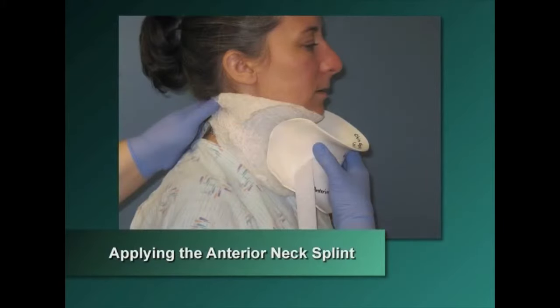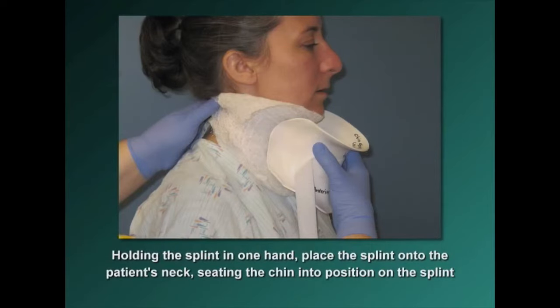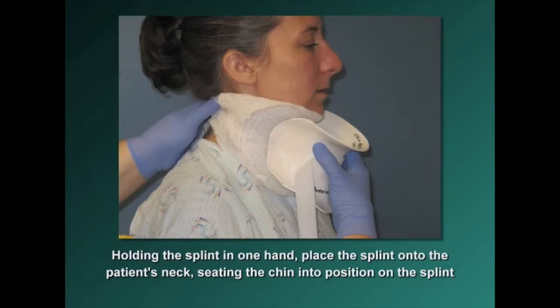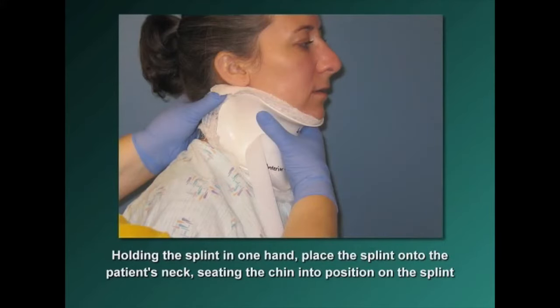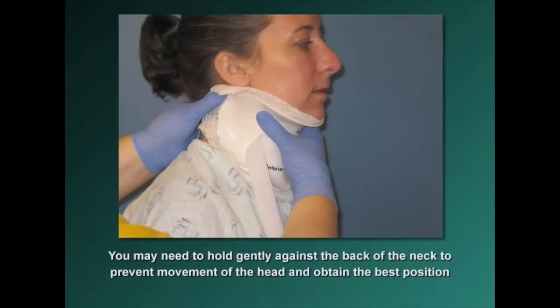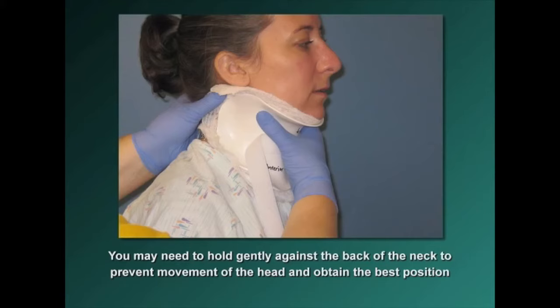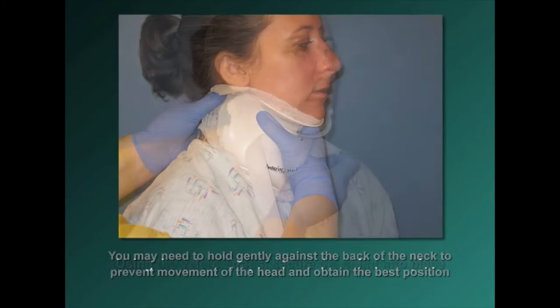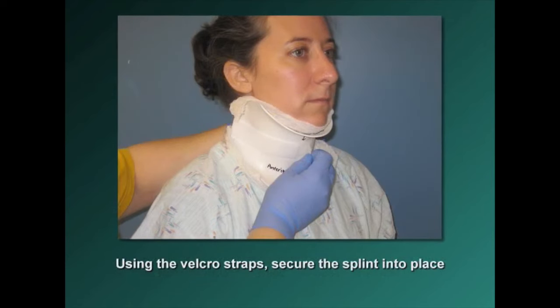To apply the anterior neck splint, holding the splint in one hand, place the splint onto the patient's neck, seating the chin into position on the splint. The nurse or therapist may need to hold gently against the back of the neck to prevent movement of the head and obtain the best position in the splint. Using the Velcro straps, secure the splint into place.